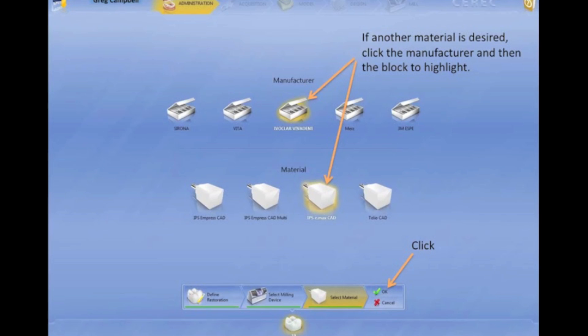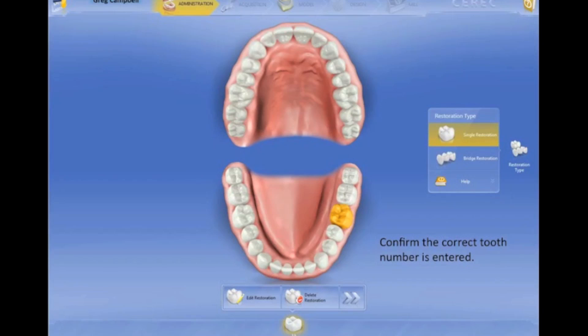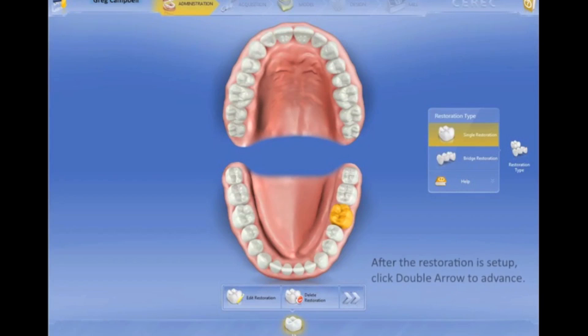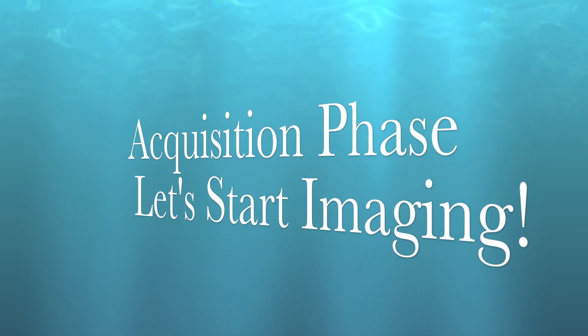Alright, so far so good. Make sure you select your material at that phase — it's going to save you a lot of time. It takes you back to this screen; make sure you have the right tooth. You can select another tooth if you want to do multiple restorations, or you just click the double arrow, which we call the Chevron, and go forward.